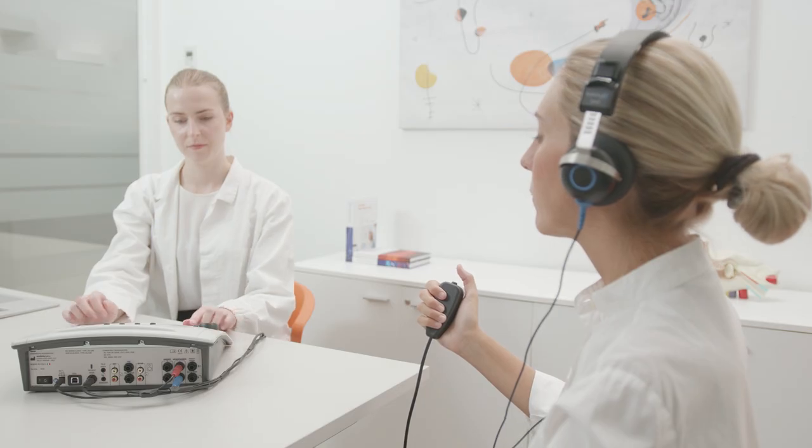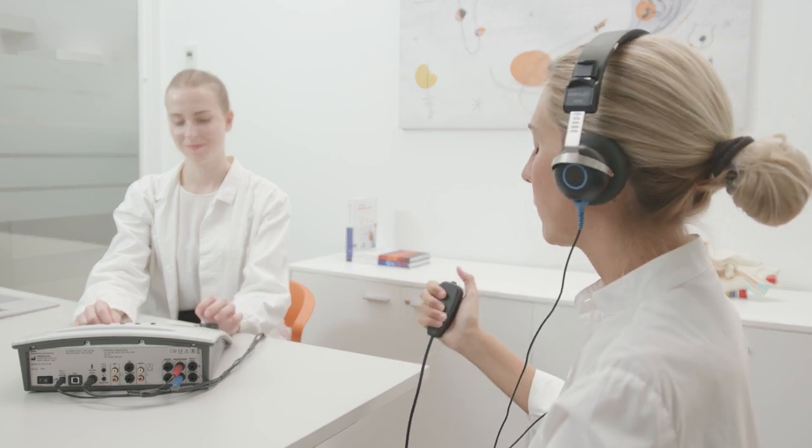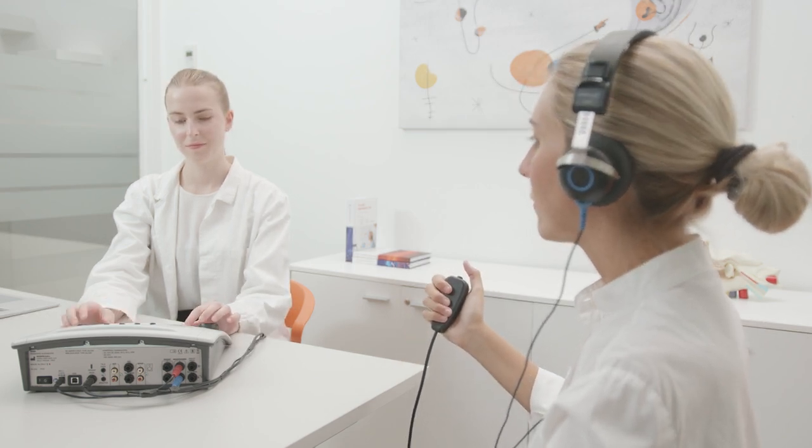During this video we will have a look at the available settings and the simplicity of performing pure tone audiometry with the HAARP audiometer.